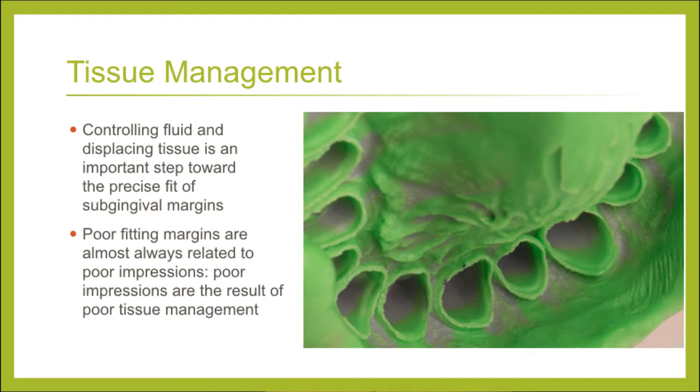We can't ask the lab, oh, just see if you can find the margins, or let us know, or if you need me to tell you where the margin is, I'll do it. Or if I need to even trim the dies, why not take it and do it right the first time? But we have to have good tissue management.